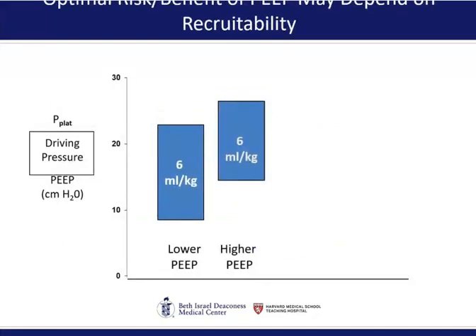So Lorenzo mentioned that previous PEEP trials have been negative. And why does that happen? Why does PEEP, which seems an obvious solution to improving lung health, and by the way, proven to improve lung health in a million animal experiments, why when we move to humans does it not seem to work? So what does a PEEP trial do?